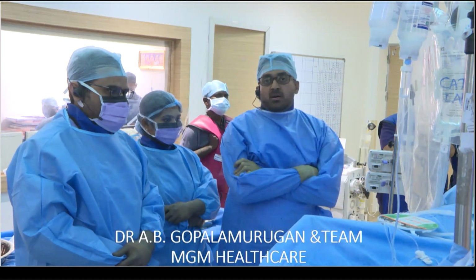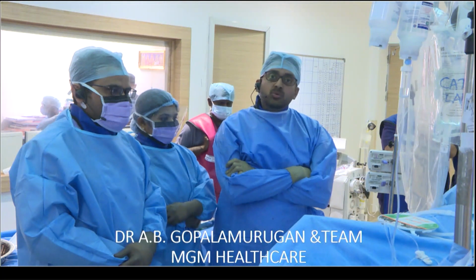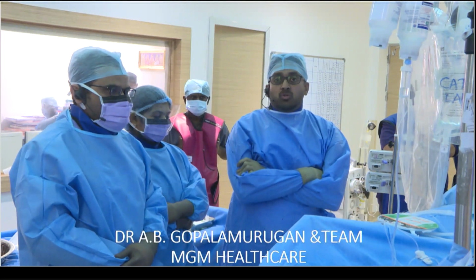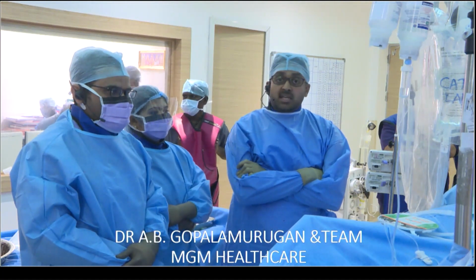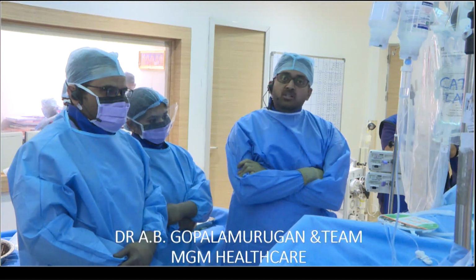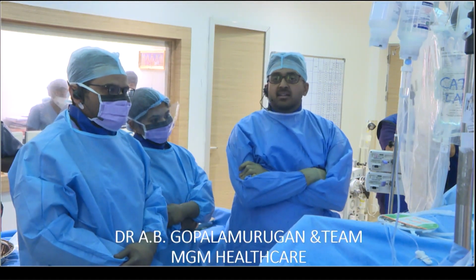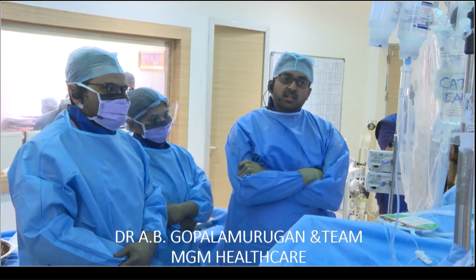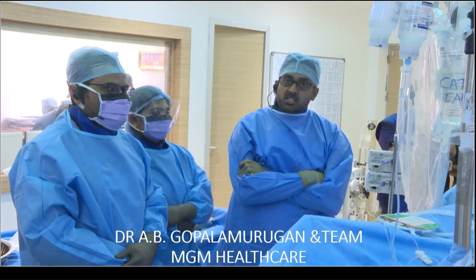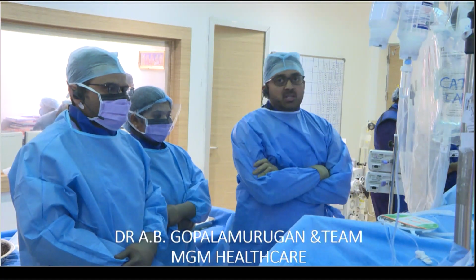So before we embark, clearly our plan is to look at the coronaries and use a dual antiplatelet regime for no more than 4 to 6 weeks. Therefore, the stent we're going to opt for is Onyx. We're going to do OCT guided to make sure that the procedural outcome is as favorable as we would like, to allow quick endothelialization and allow him to come off dual antiplatelet to have a safe liver transplant. So all these endpoints are being borne in mind before we start this case.